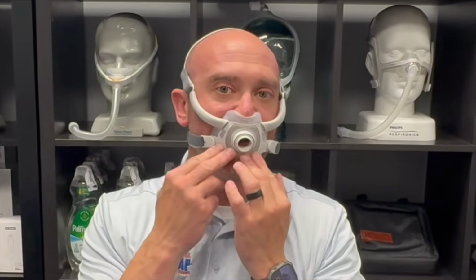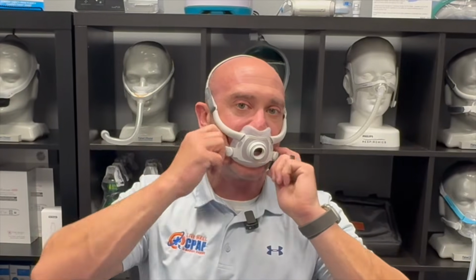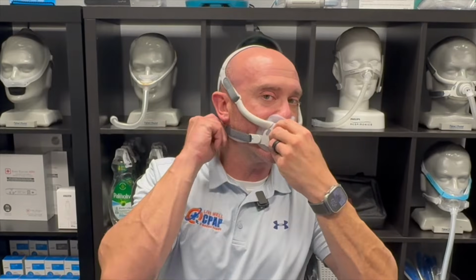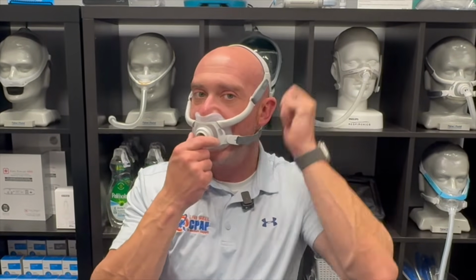Now, one thing that I found about this mask is if you do over tighten it, it's a very soft mask, which makes it very comfortable, but it can fold up on the inside and can cause leaks if you do over tighten. One thing is, if you are getting leaks in the middle of your therapy, you can push this mask in a little bit to get rid of the leak, and then just take the slack out of the straps, both sides, and a little on the top as you're doing that, just to tighten it just enough to get rid of the leak. And then, of course, to get out of it, you just pop it off like that.